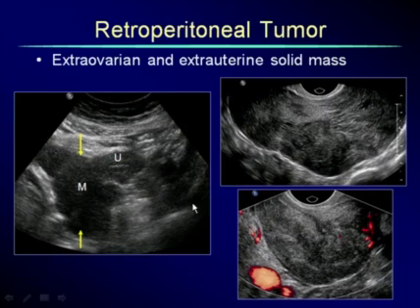So occasionally we'll see a pelvic mass. Now this is the uterus, transverse pelvic scan. Here's the uterus endometrium. And in the right adnexa pelvis, there's this very lobulated, solid looking mass. We do transvaginal and that confirms. It shows us things a lot nicer, the soft tissue differentiation here. But all in all, it's a solid mass.